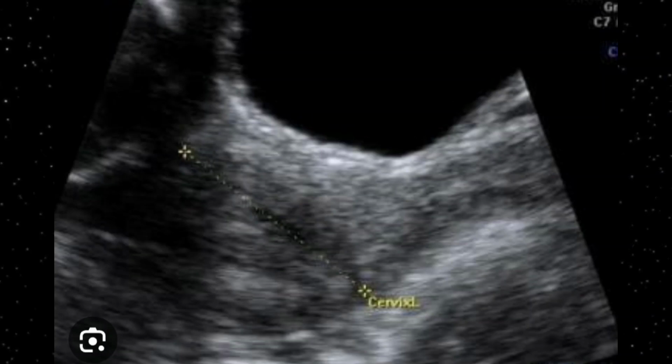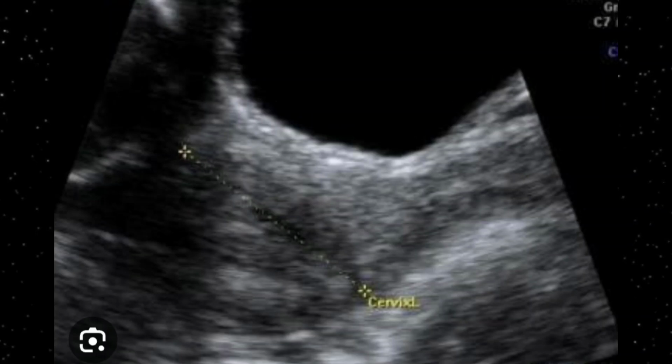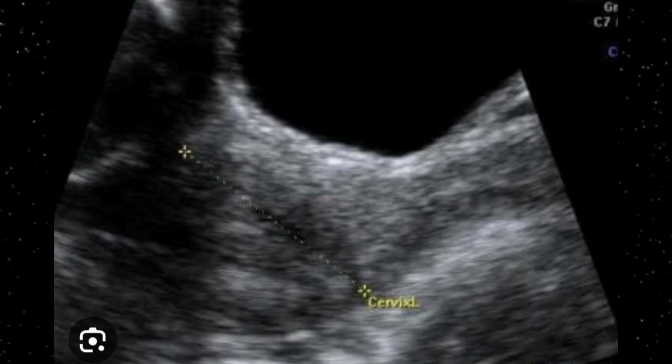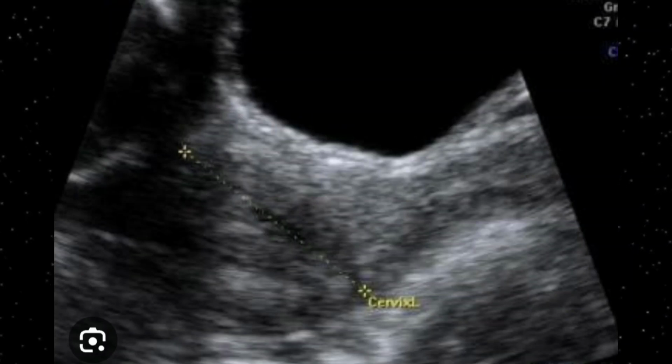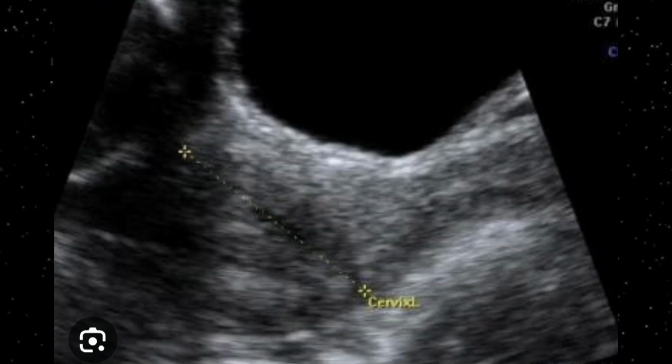Besides this, if you look towards the left on the superior part, you can see that the internal os is also dilated and shows a small amount of fluid, like amniotic fluid, gravitating towards that side. However, the endocervical canal is still collapsed, not yet that much dilated, but as the cervical length is reduced, cervical width is also reduced, so there is a likely chance of abortion.